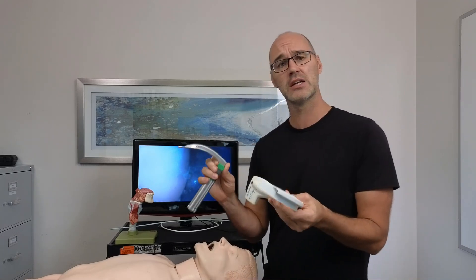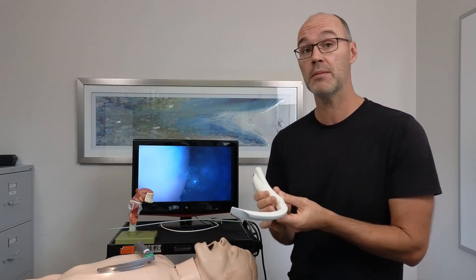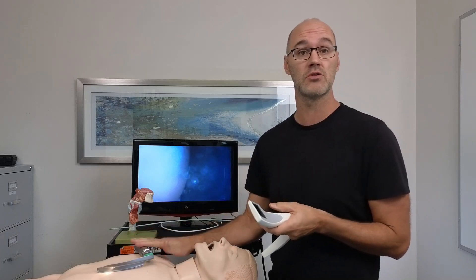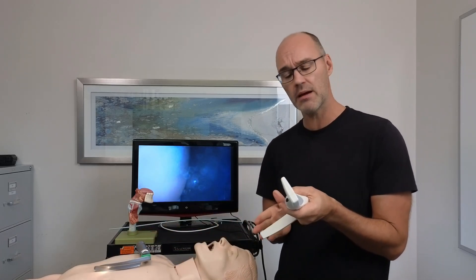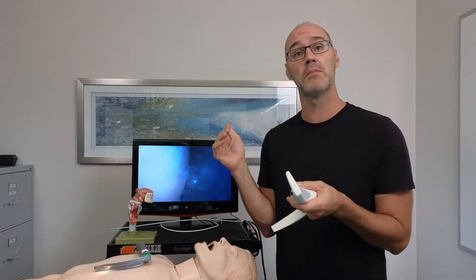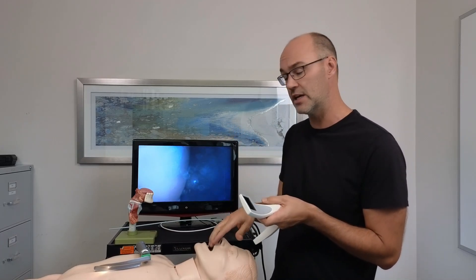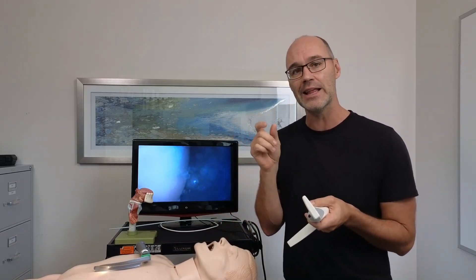With a Macintosh style blade, we're going to be able to use it just like a Macintosh direct laryngoscopy. Often the camera will get us a little bit better view than we may have got just by visualization through, but only slightly.